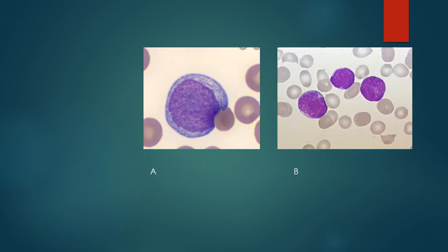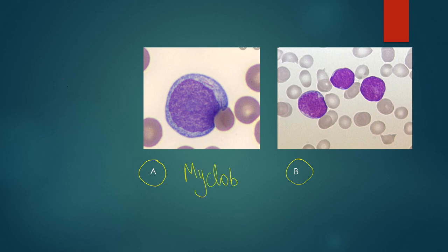This is cell labelled as A and this is cell labelled as B. Cell labelled as A is a myeloblast, whereas cell labelled as B is a lymphoblast.